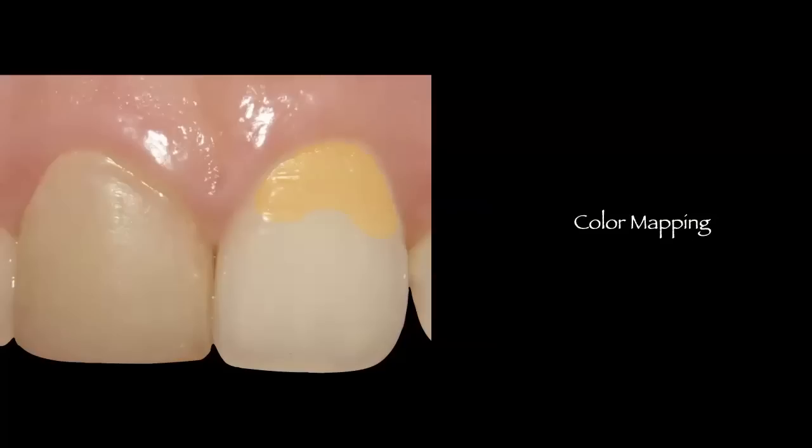just to make sure that I can remind myself that if I am going to choose a dentin shade for this portion of the tooth, I'm going to have to choose a dentin shade that is more saturated than the one that I would choose for the middle third. So let me just give you an example. If the basic color for this tooth would be A2, I know that I'm going to have to use a higher saturation shade for the gingival third. So that would put me most likely in an A3 shade for the gingival third.